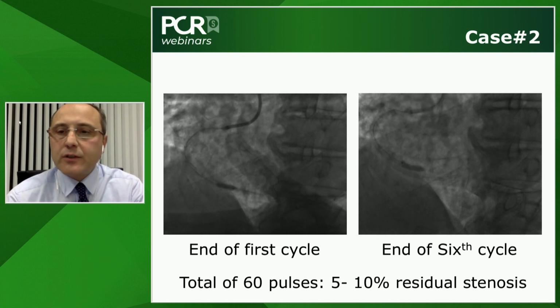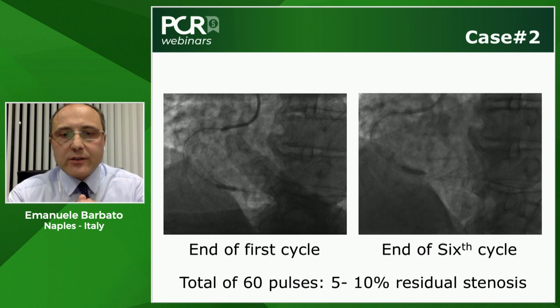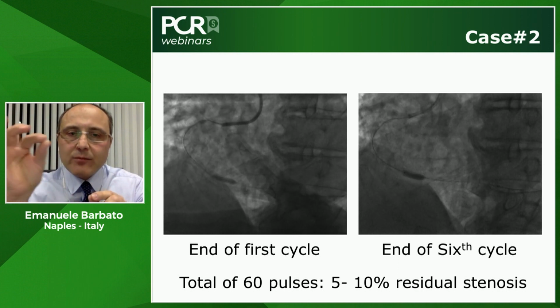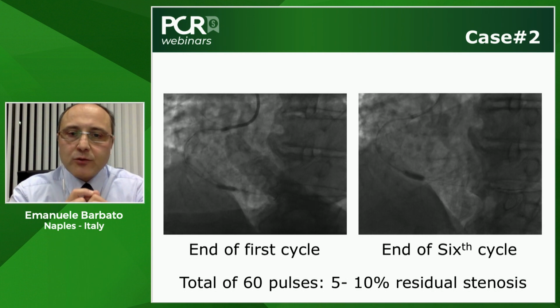Because then we have the opportunity also to address one of the points of the colleagues. So first of all, I'd like to ask you whether you had a lot of friction with these two wires, one next to each other, when nicely demonstrating this advancing of the IVL balloon, of the Shockwave balloon, up to the distal lesion. Any friction there?